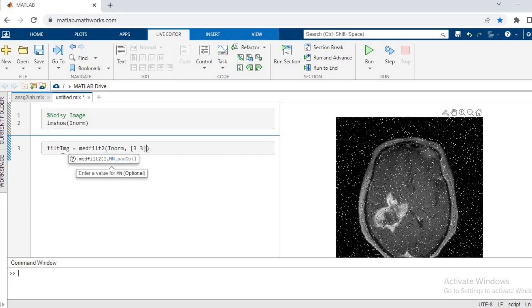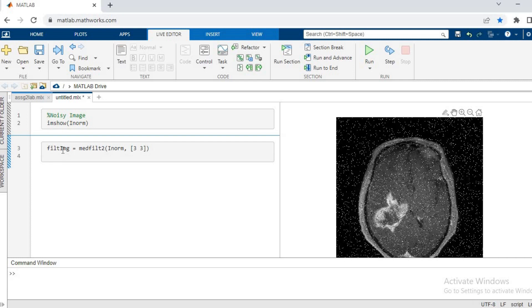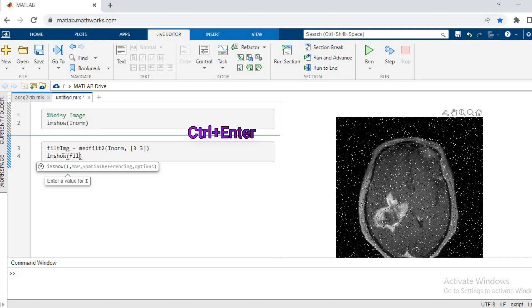And then in the resulting image, we can see by imshow bracket filled image. We press Control and Enter.